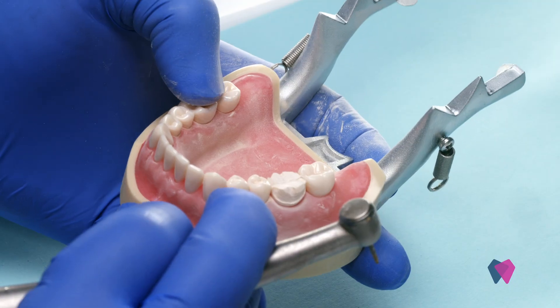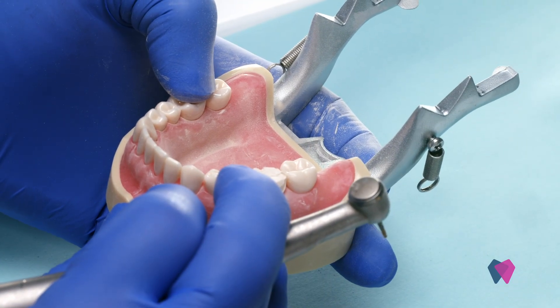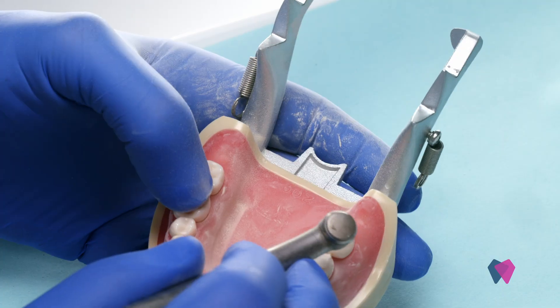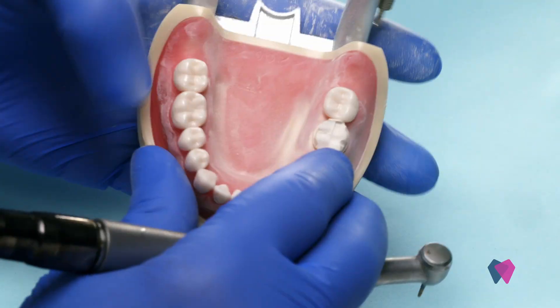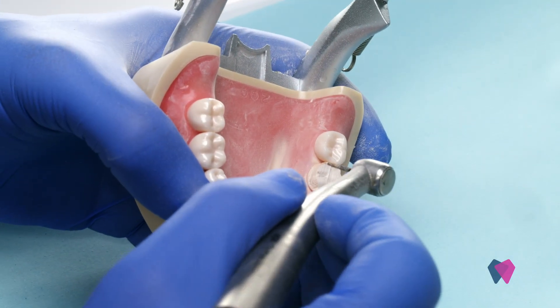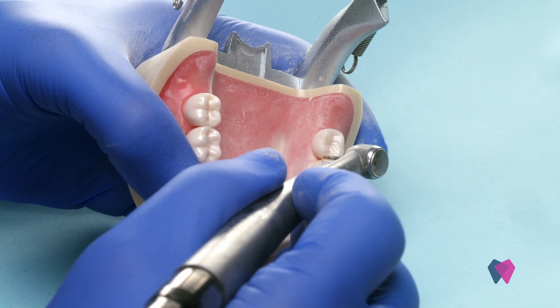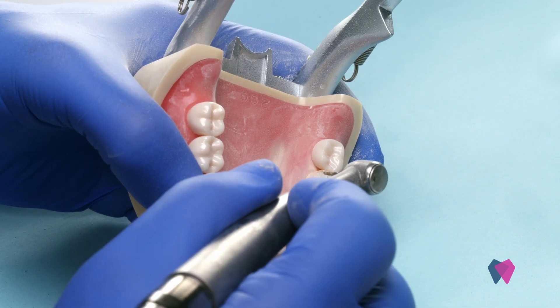So we've got our reduction on the facial and the lingual surfaces. Now let's try and go interproximally. You can use this burr, or if you find that it's too close, you can always go to a thinner burr. Let's start with this one first.